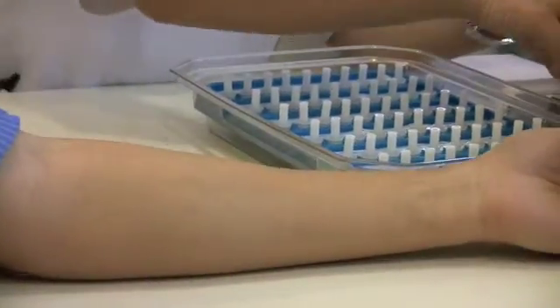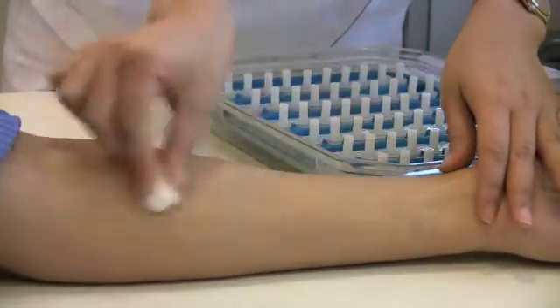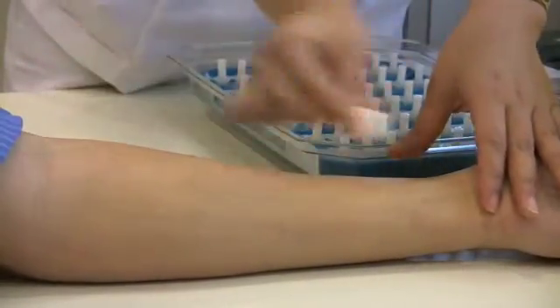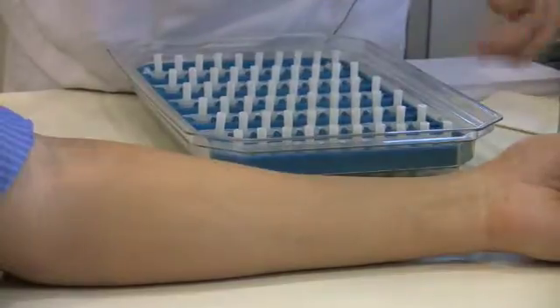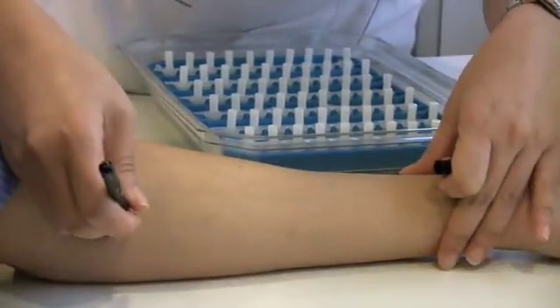First, the skin is cleaned with alcohol. The positions are then marked using a grease pencil.